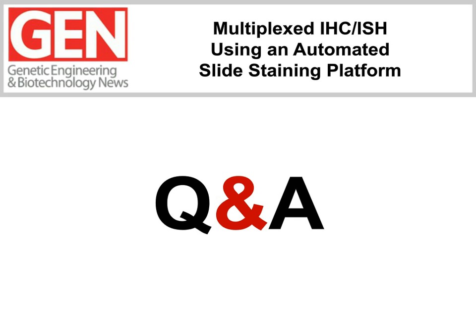Yeah, actually, that is another method for multiplexing that one can utilize. I didn't quite go over this just for time constraints, but yes, you can definitely hapten label your primaries and detect them with the respective anti-haptens. Just something to consider when you incorporate this technique is that when you are modifying your primary antibodies with these tags, be careful because you may compromise the affinity binding region of these primary antibodies, and also you may be compromising the tertiary structure of these antibodies and thus affecting their overall stability.